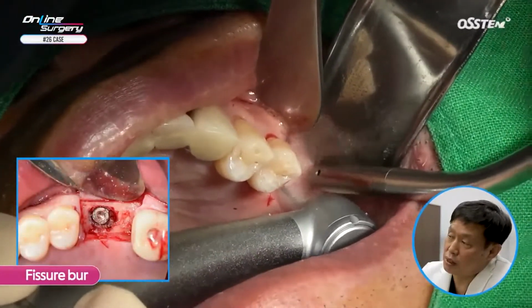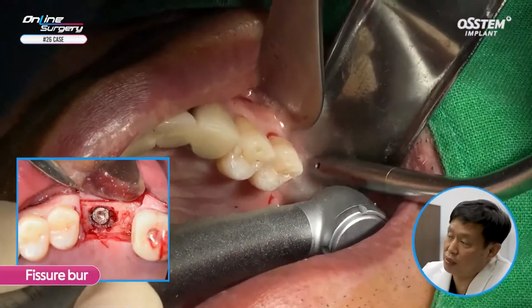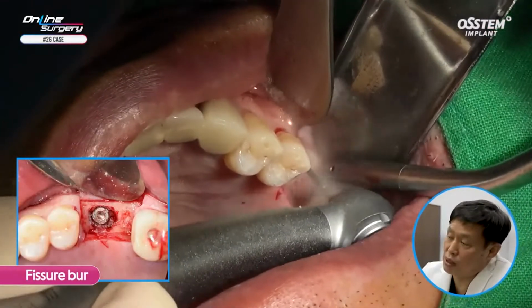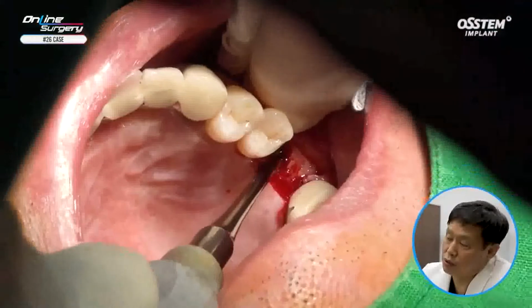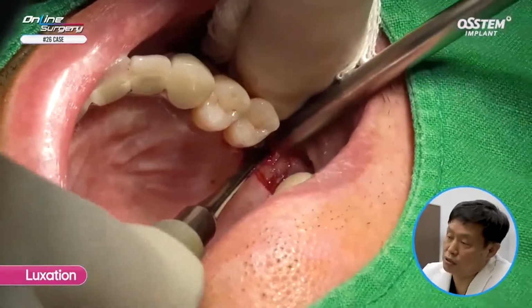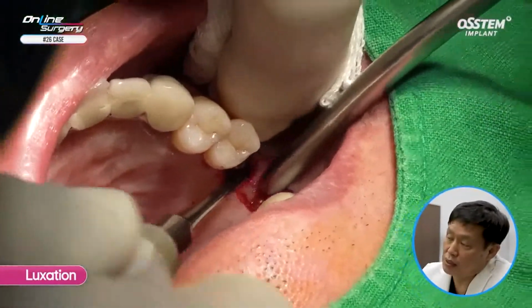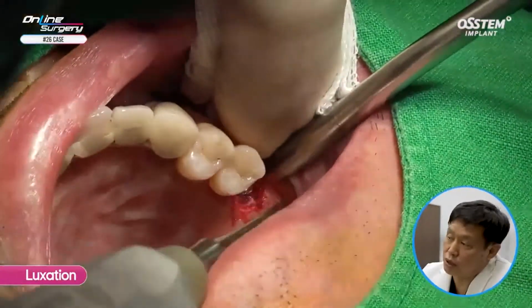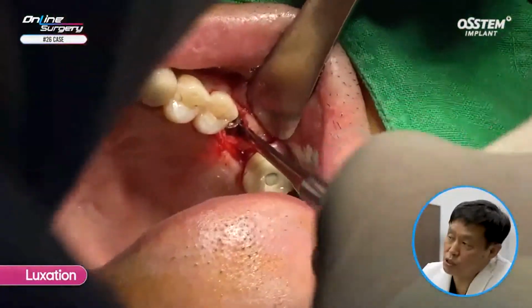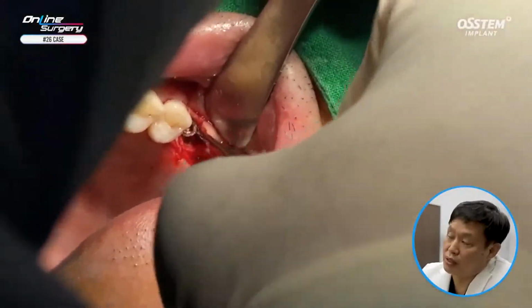As mentioned, the buccal plate is extremely thin. In order to preserve this, I'm going to use a thin fissure bur and prep the site where a fulcrum can be gained. The elevator is going to be used to luxate the implant. It was an 11.5 long implant.